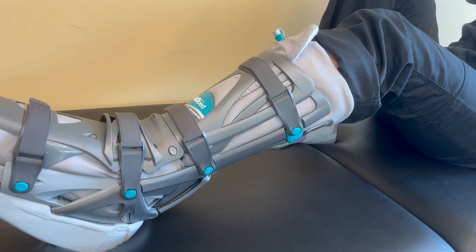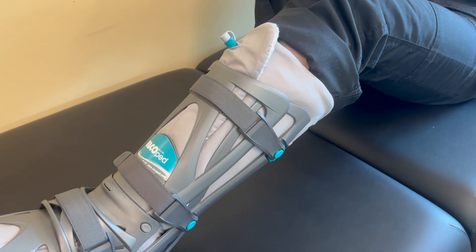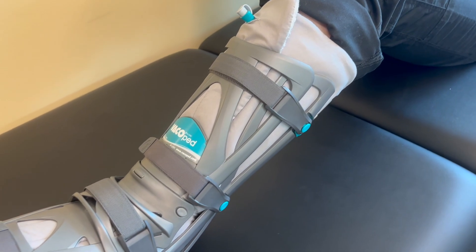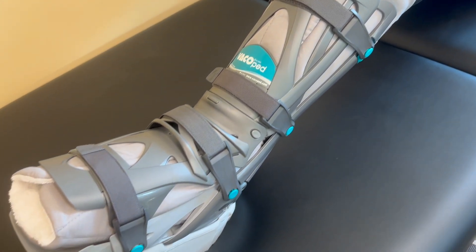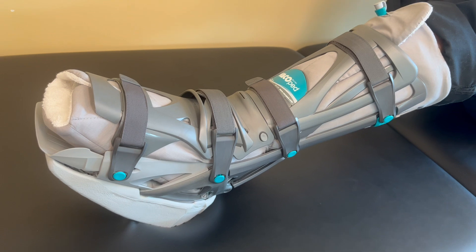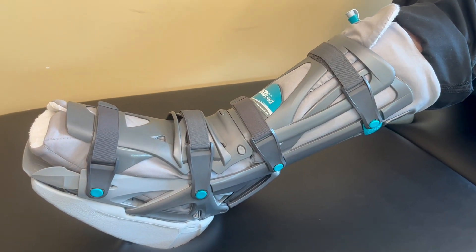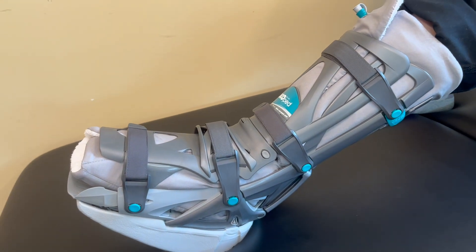This boot also has the ability to achieve range of motion with both dorsiflexion and plantar flexion. The indication for use is the Achilles Tendon Rupture. Boston Bone and Joint Institute bills this durable medical equipment item to your insurance company. Please contact your insurance company for your benefits or contact our office for additional information.